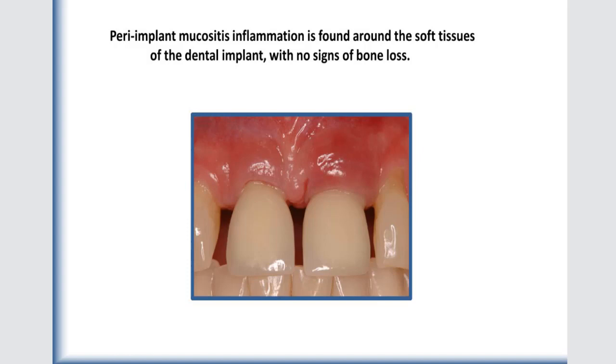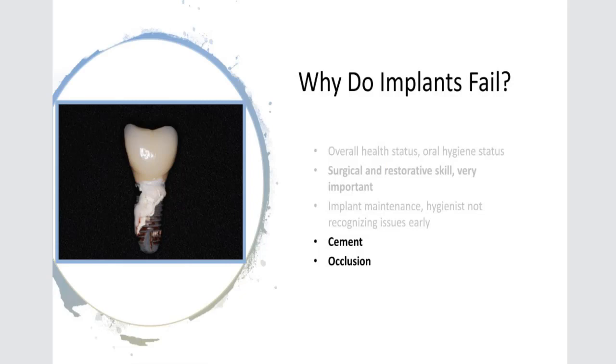Somebody's asking, has this been used with ortho patients? Yes. Glycine has been tested in the mouth everywhere. It's a very effective way at removing biofilm. How you use the glycine is what we're talking about tonight in that single unit dose. So please feel free to add any more questions around air clean. Go ahead. We're going to take some time at the end and answer them.